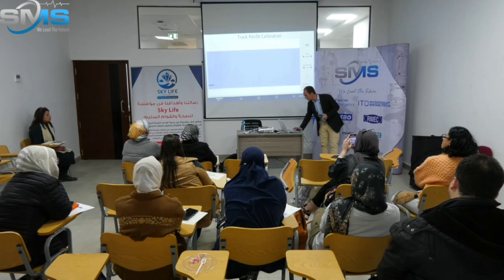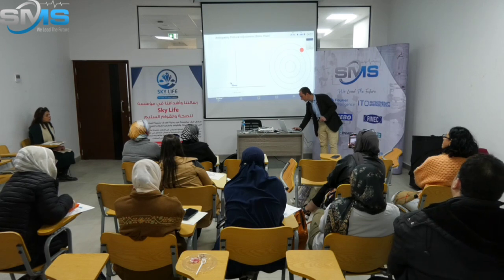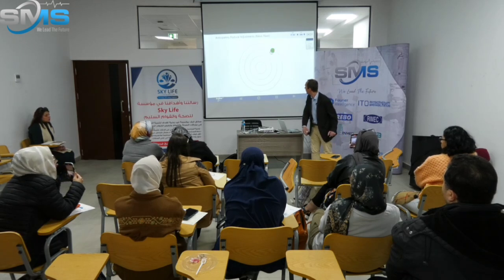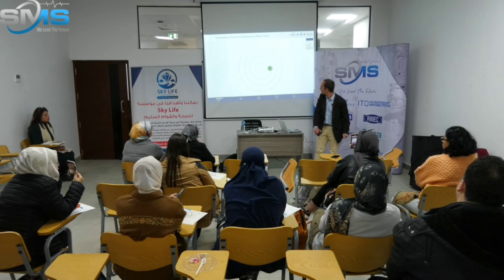Because now I don't see my contraction anymore. I can hide my contraction totally. Now my patient is just on a platform and she has to move to get the point. You see? I move, I get the point. Moving to get the point.